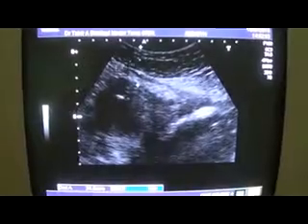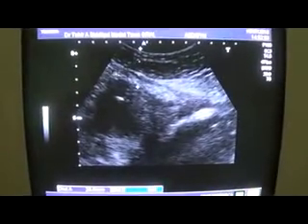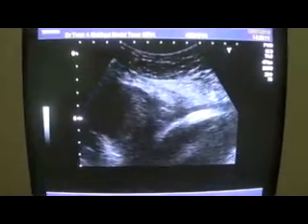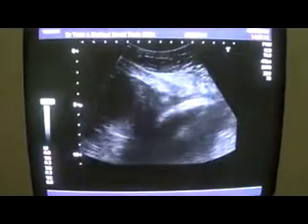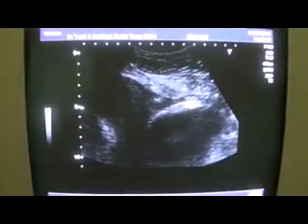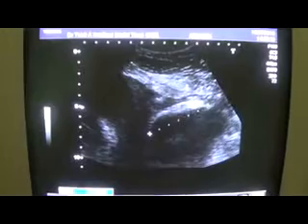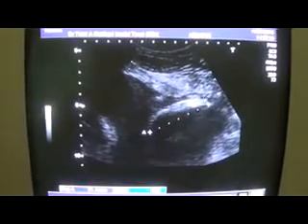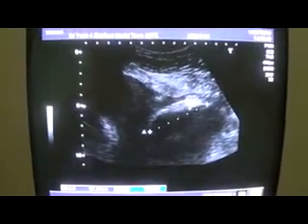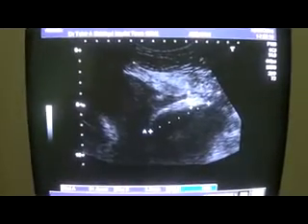This is the subcutaneous tissue, and the peritoneum you are seeing. This is the peritoneal line. Now what's elevating it is an echogenic area measuring approximately 6.1 centimeter in length and 8.6 millimeter in anterior-posterior diameter.